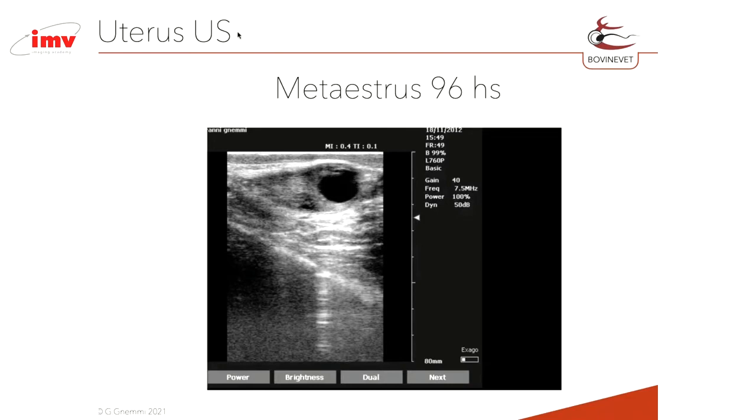The vascular tone is reduced in size, and the edema of the endometrium disappears totally, so the endometrium is reduced in thickness, and the echogenicity is improved. And normally inside the uterus we have only a virtual space for the fluid. We have some specular reflection, but not too much, as we have instead during the first 2 days of the estrous cycle.